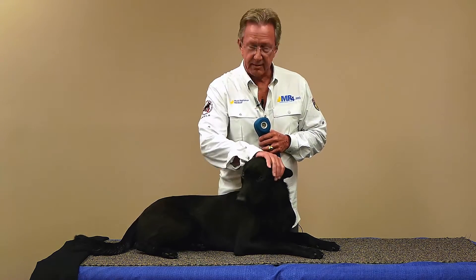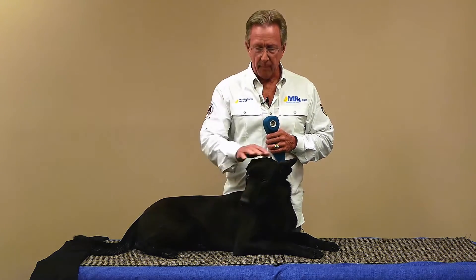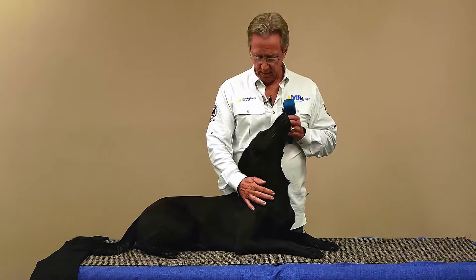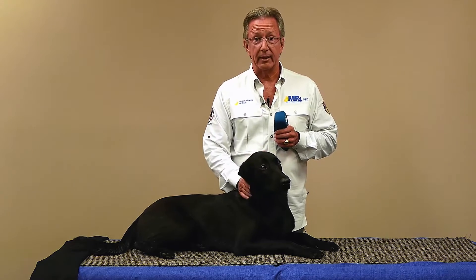Especially afterward to reduce that inflammation and really keep them in peak form like this wonderful fellow right here. Eric is a great example — he's undergoing a lot of intensive training, but as part of that we want to extend his career and keep him in top performance condition at all times. Today we're going to talk about the ActiBet Pro specific applications for any dog, even a dog like this, to keep them in optimized condition.